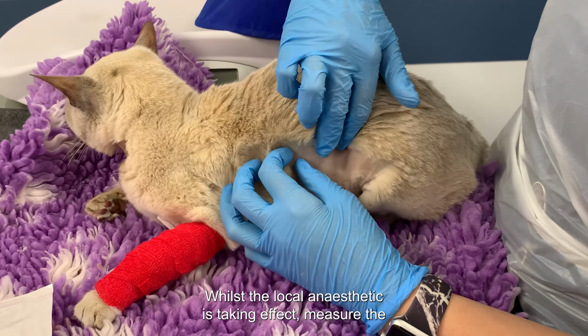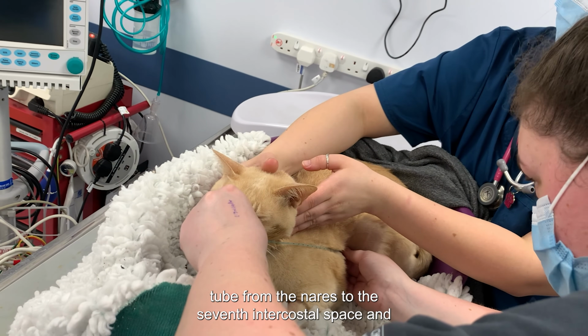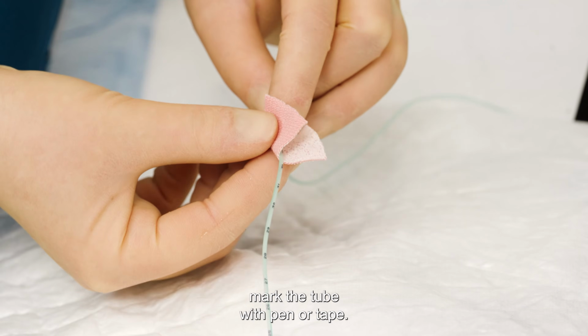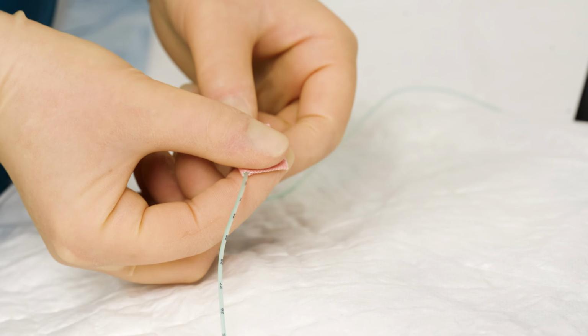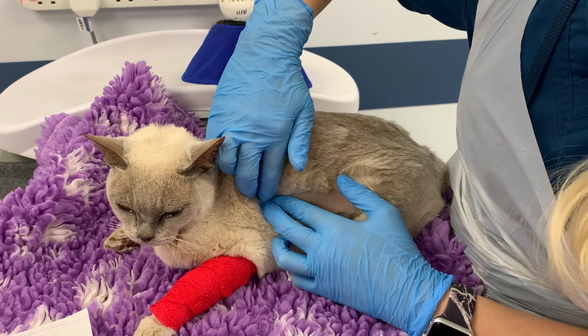Whilst the local anaesthetic is taking effect, measure the tube from the nares to the 7th intercostal space and mark the tube with pen or tape. For nasogastric tubes, measure to the last rib.